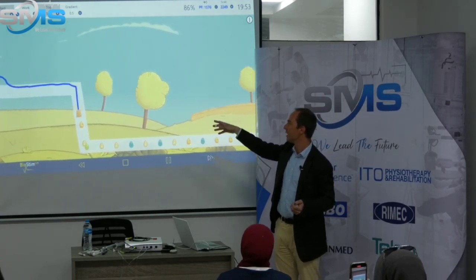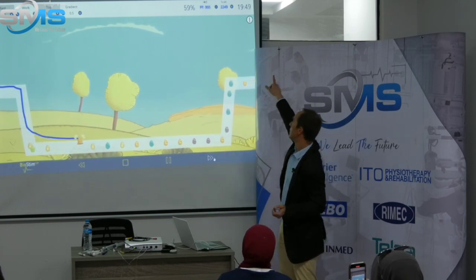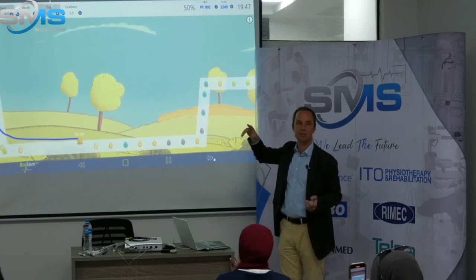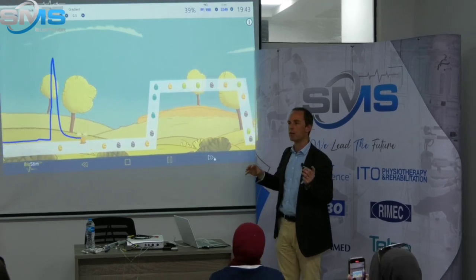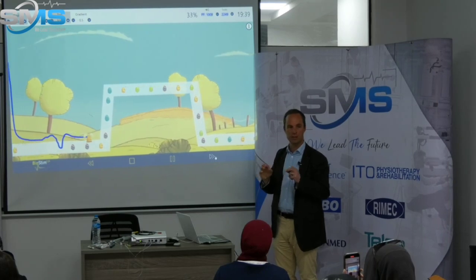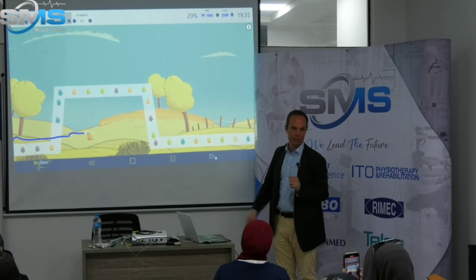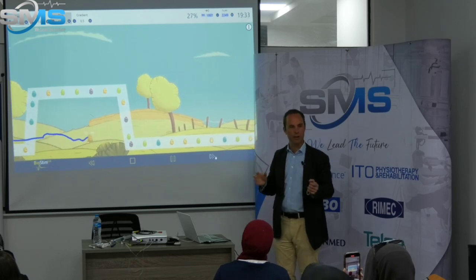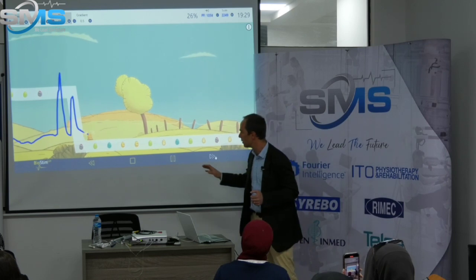The goal of this kind of exercise is to make it less boring, because the session lasts about 20 minutes, and 20 minutes of squeezing and relaxing can be quite boring. So you have to find a way for your patient to keep motivation. So using animations, using different exercises, whatever you can find is good for her. And so here you see, I'm not very good, but whatever.